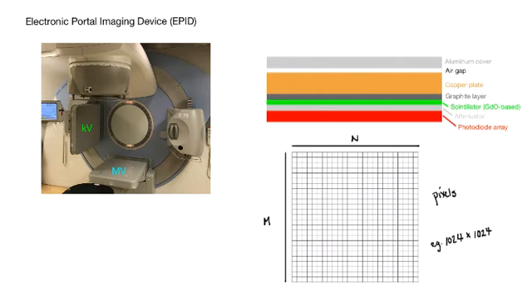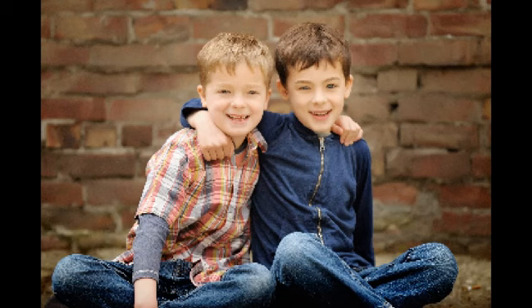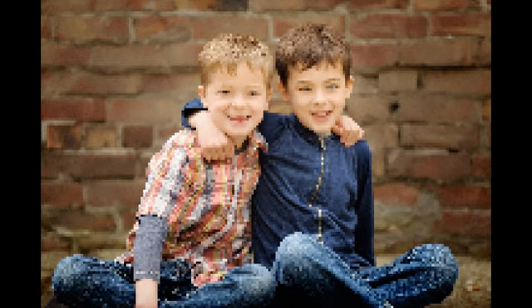Now, these pixels are going to affect the resolution of the image. So let's look at this through an everyday example. You remember these guys. They made a guest appearance in some of our videos, the kids. So this is a nice high resolution image, lots and lots of pixels. But what happens now if we reduce the number of pixels in this image? So let's look at that. A factor of 2 fewer, 2 more fewer, half it again, you can see the resolution is getting much worse until you almost can't see the image.